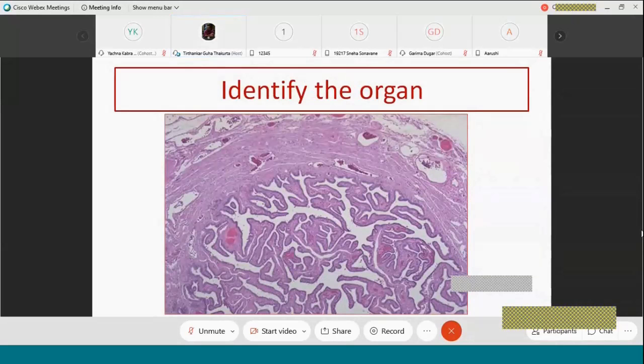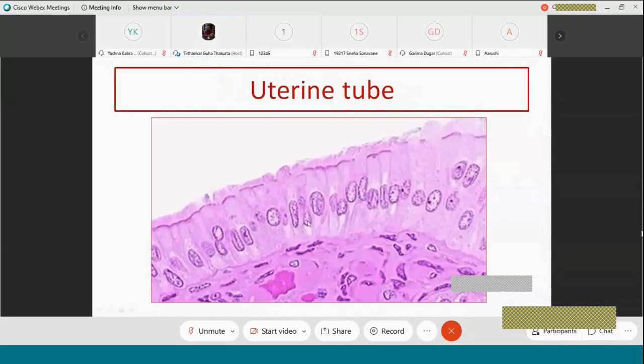If you look very closely, the uterine tube is lined by columnar epithelium. There are cilia on top of this that help in movement of the ovum. There are some unique cells in between that do not contain cilia but some protrusions. These cells are called PEG cells, PEG. The PEG cells secrete some chemicals that help in capacitation of the spermatozoa.